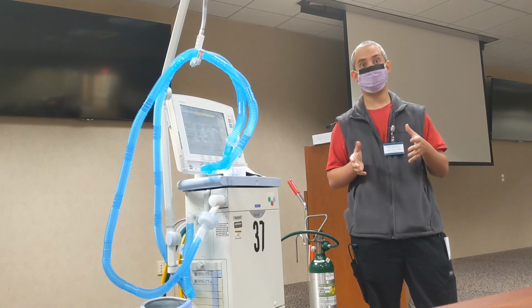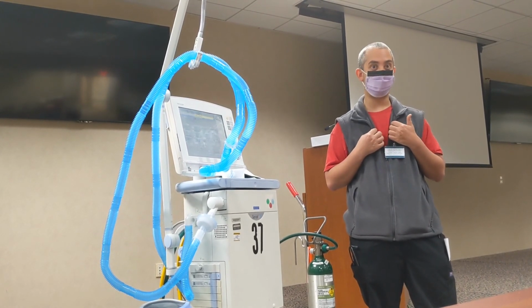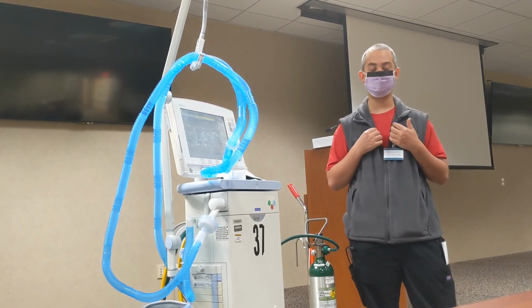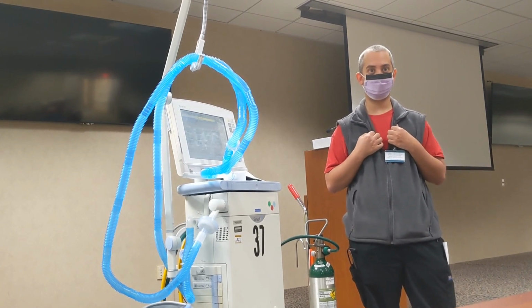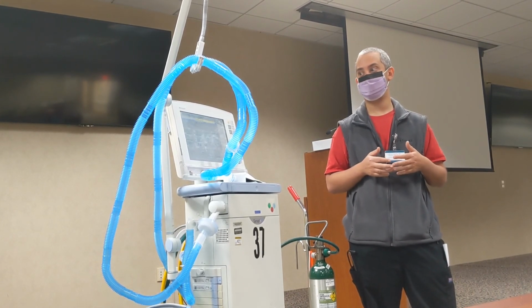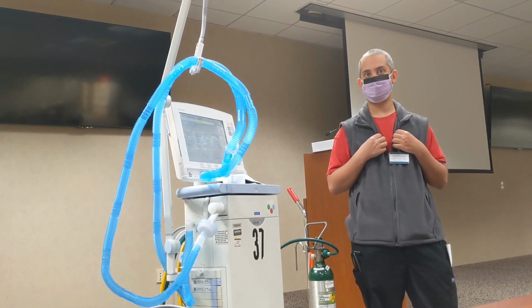But really, if you're matching the minute ventilation and you have a SAT monitor, you can kind of guess what it's going to be, and most of them will have end tidal CO2 too, and you can kind of guess where you're at. But when putting them on initially, definitely, and if you're making significant changes, then I would probably check too.